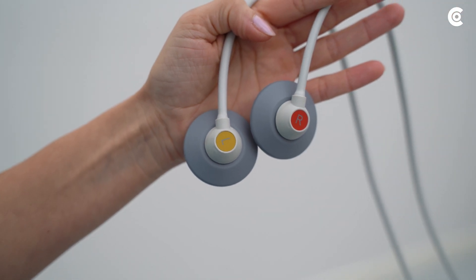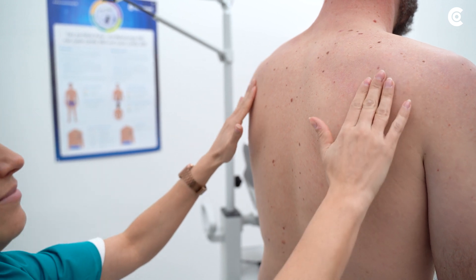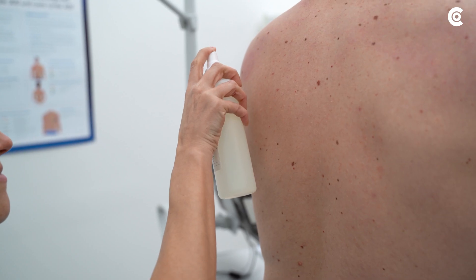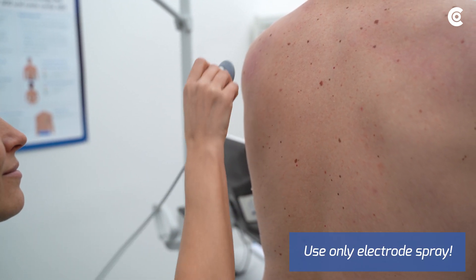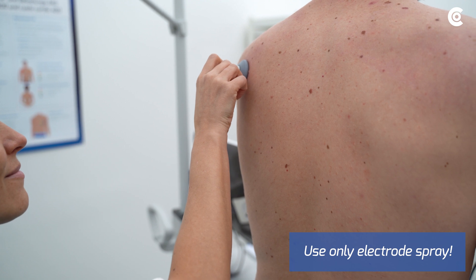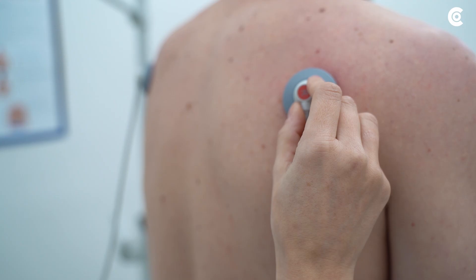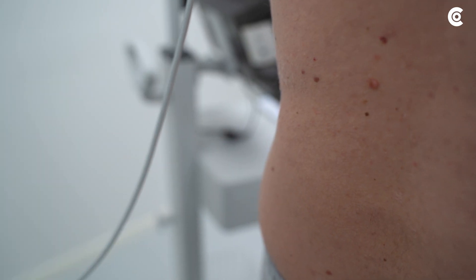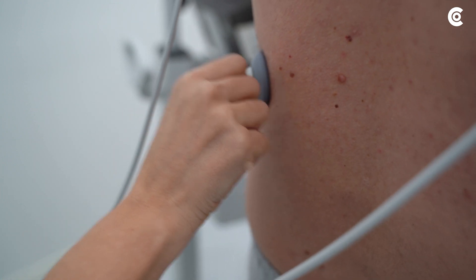The electrodes for the limbs are positioned on the anterior or posterior thorax with shortened cables. We recommend applying them on the back because there is less movement than at the front of the thorax. The electrodes L and R are placed on the posterior deltoid muscle left and right. Electrode F on the ninth rib left and electrode N on the ninth rib right.